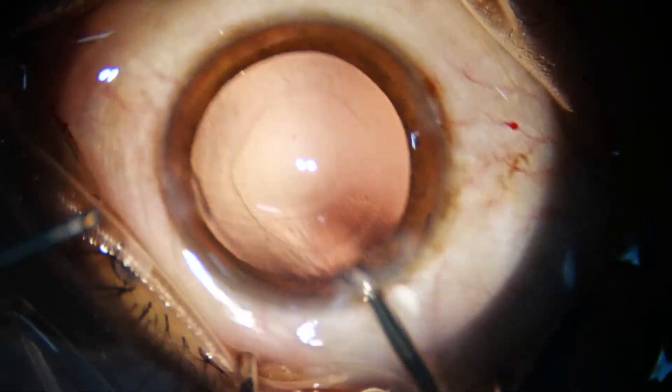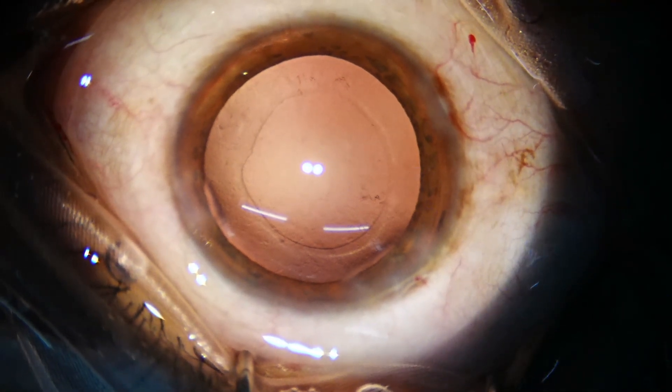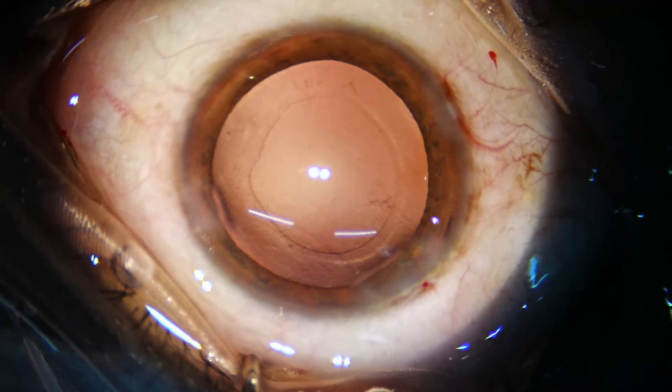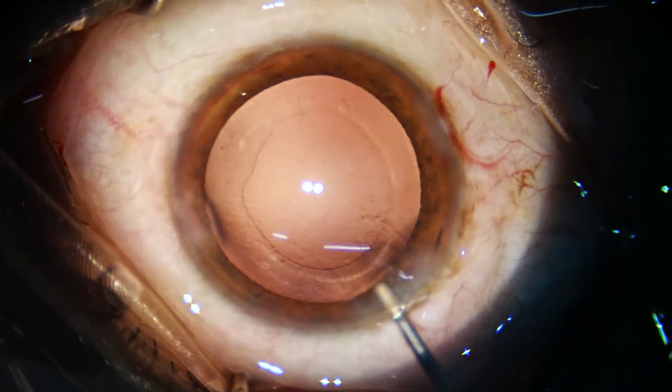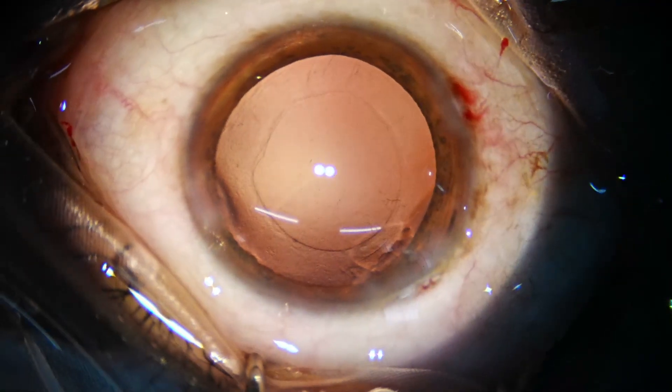Now we inject this plastic substance to inflate the capsular bag and fill the anterior chamber. This plastic substance is two percent hydroxypropyl methyl cellulose.